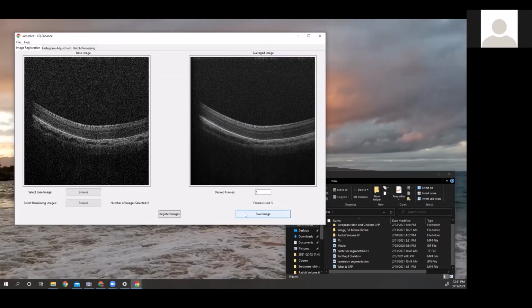So let's look at some of the obvious things. If you look at the overall screen, you can see there's less noise in the averaging. So that's one of the improvements with doing stacking and averaging, is that noise, since it doesn't have a continuous signal, gets basically canceled out.